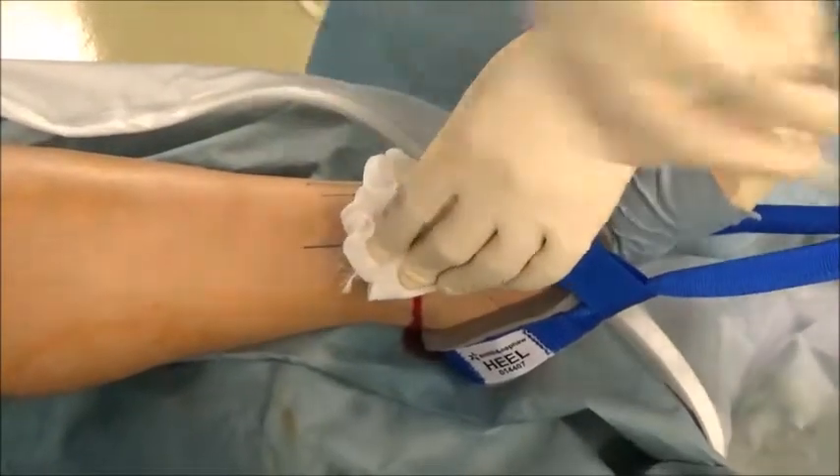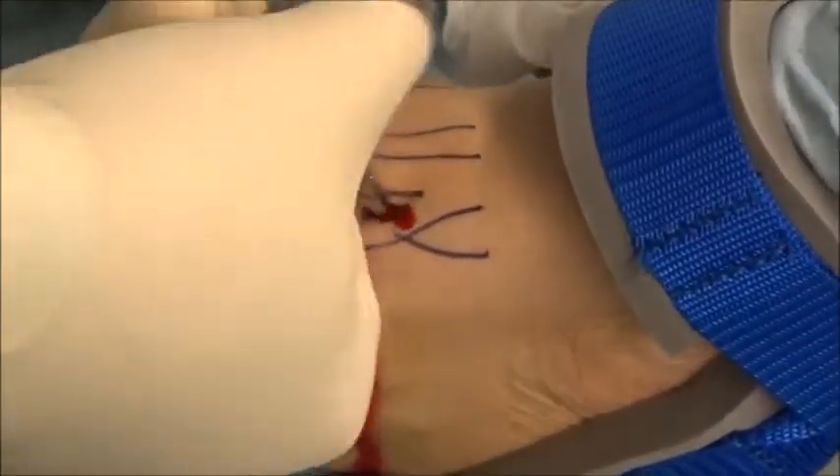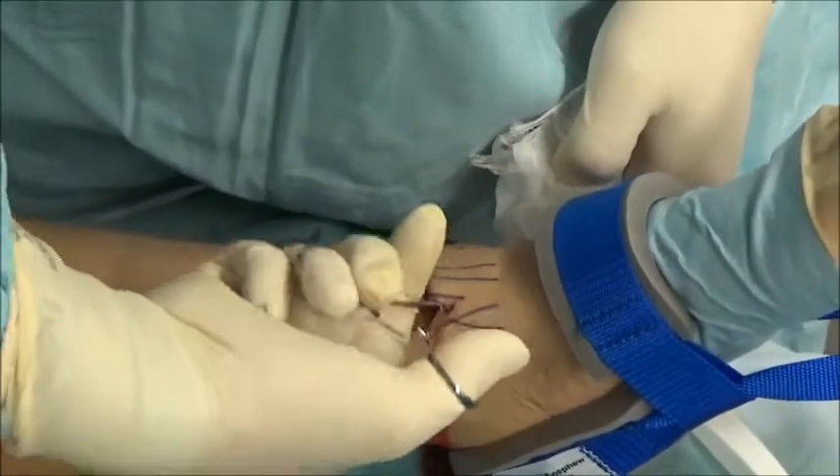Medial to the anterior tibialis tendon, taking care to avoid the marked veins. After the incision, the deeper layer is penetrated to the joint capsule using mosquito clamps, and the joint is accessed with these clamps.